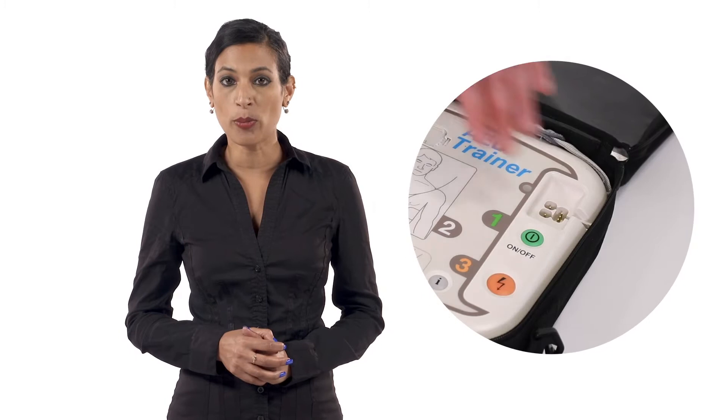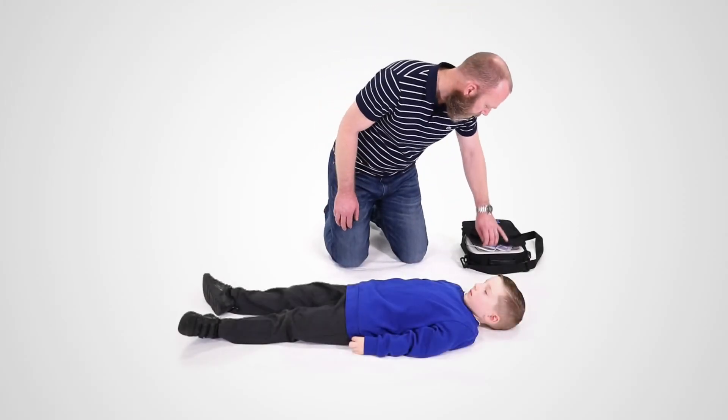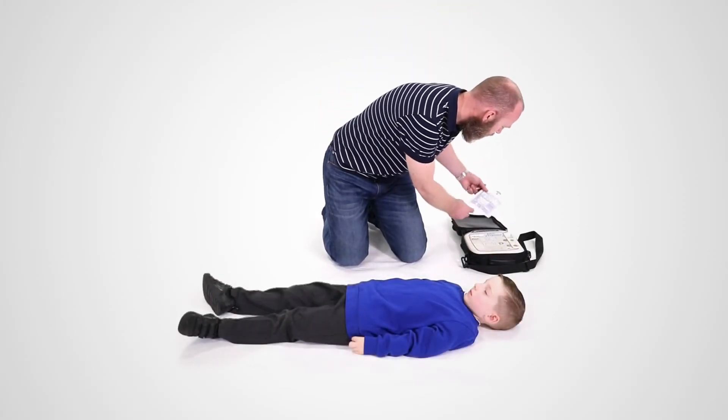Once an AED has been brought to you, ask someone to help you by switching it on and following the prompts to apply the pads so that you don't have to stop giving CPR. When switched on, the AED will immediately start to give you visual and verbal prompts telling you what to do. The AED prompts will give instructions similar to these.